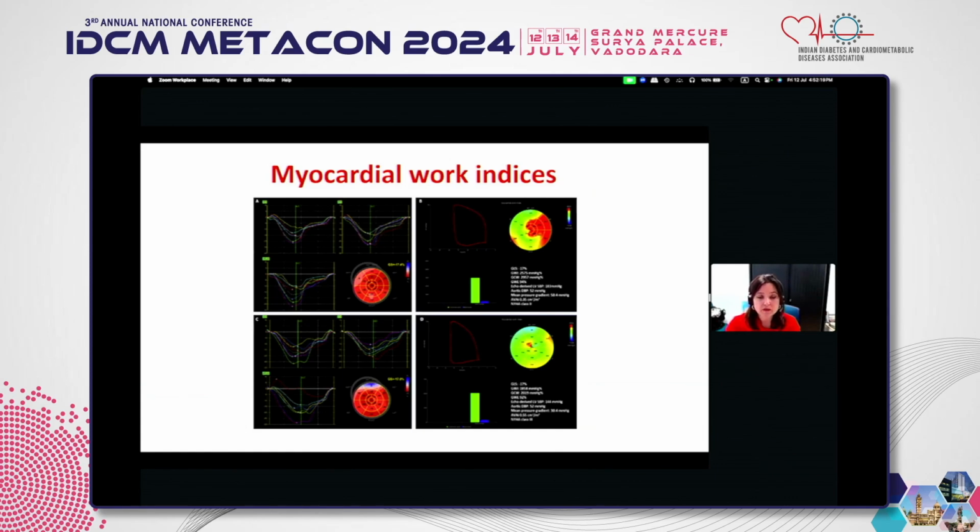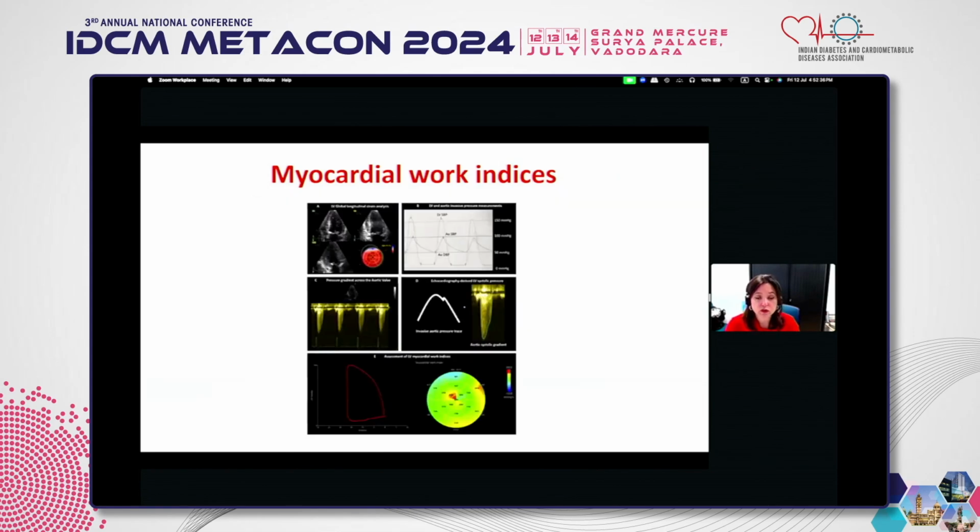the strain. So this is probably a little bit more advanced, more research level, but it is to think that we should always consider the condition of the patient, what is the blood pressure when we are measuring these parameters. And this is, of course, very true in case of aortic stenosis, because it's not only the brachial pressure, but it's the valve giving much higher afterload to the ventricle.